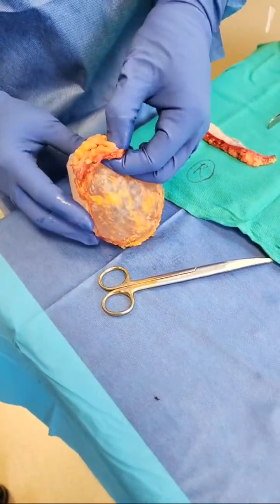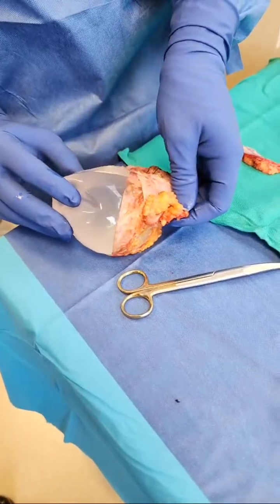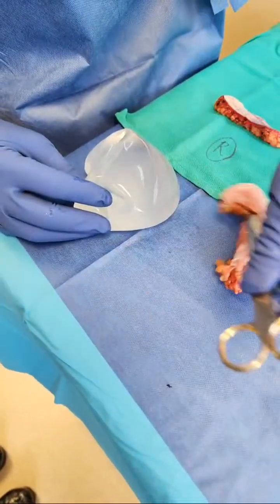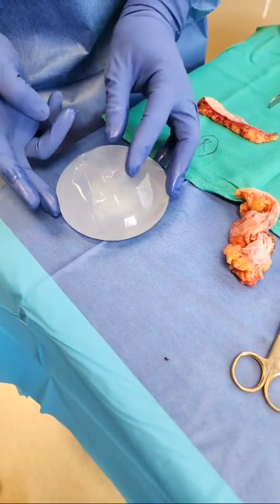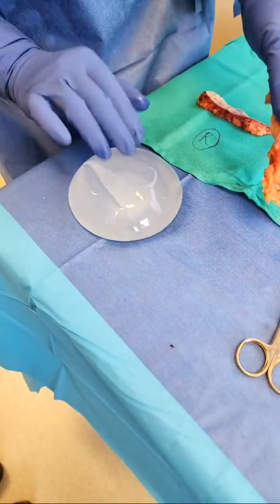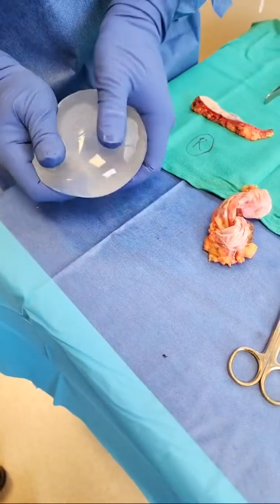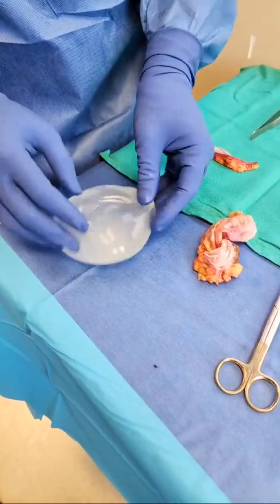So as you can see, right, I'm just going to try to preserve it in the manner that it was. So it was like suffocating and holding the implant together. So as I let go, you'll see the implant is going to assume its shape, and you can see how this crevice has formed where this was. Now the implant is very much intact. None of this fluid leaked out. This is an intact implant. This is your Allergan 345 intact silicone implant.